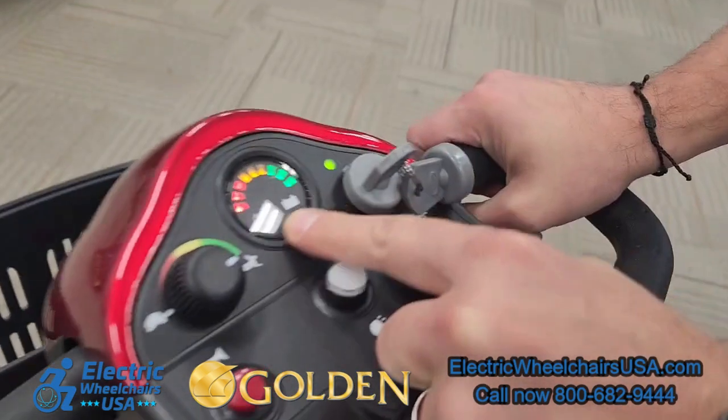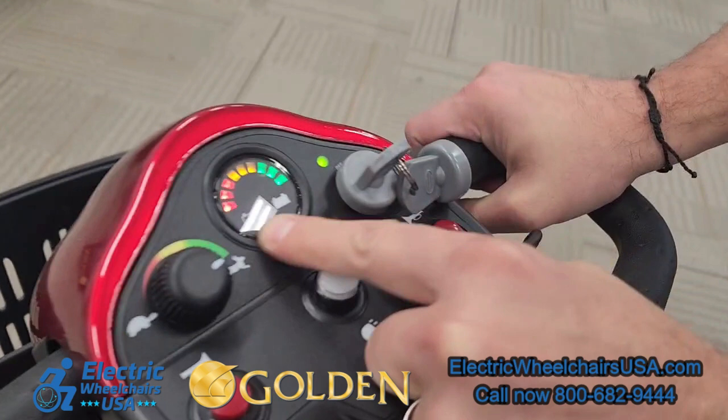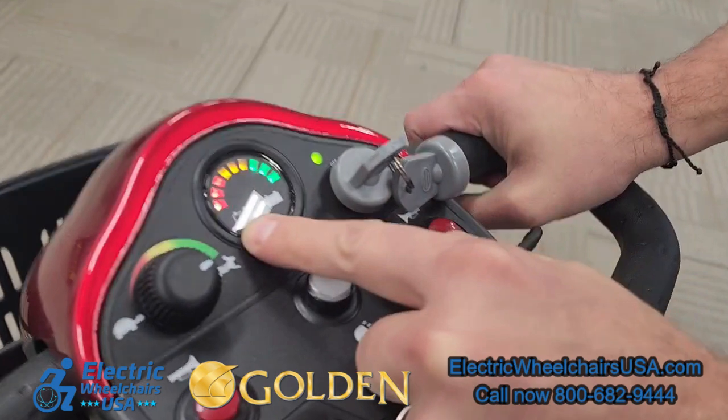This is the battery gauge. When it's fully charged, all of the bars will be lit up. When it gets down to about halfway or a quarter of the way left in your battery life, we recommend that's a good time to recharge the batteries. If you get in the habit of doing that, it'll increase the longevity of your batteries.